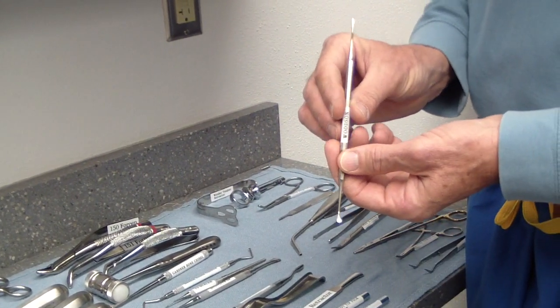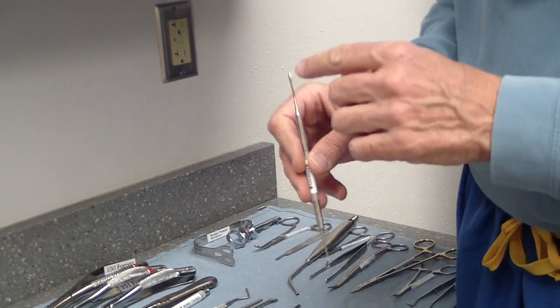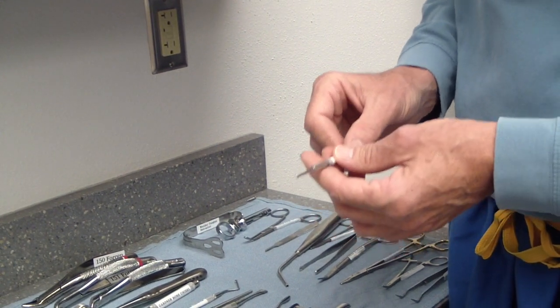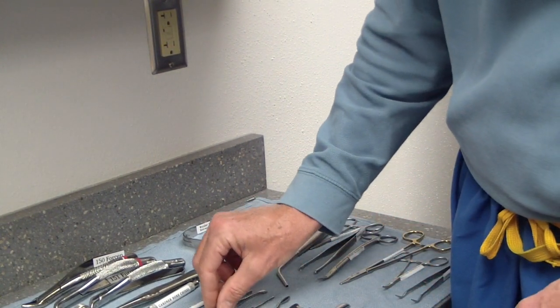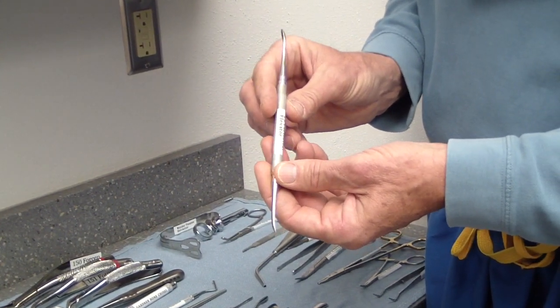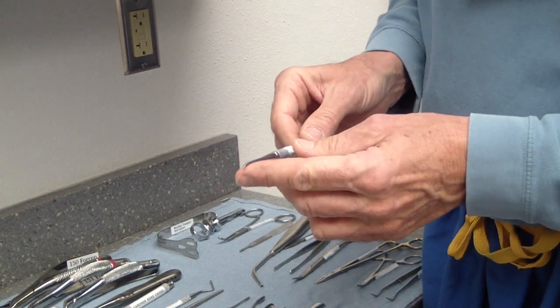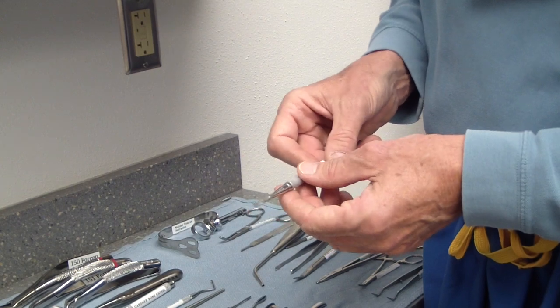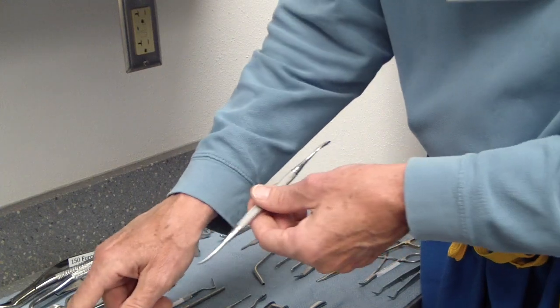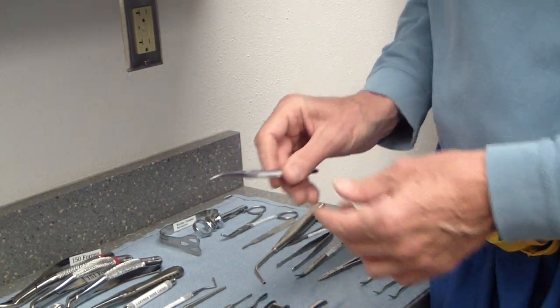This is a Woodson, which I use quite a bit to initiate my flap after making the incision with the scalpel. The little sharp edge here is better for initiating the flap. It's kind of weak, so once the flap is exposed I'll transition to the number 9 Molt, which is a stronger instrument. I also use the number 9 Molt's pointed tip almost like an elevator to get in between two teeth, then switch to bigger elevators once initiated.